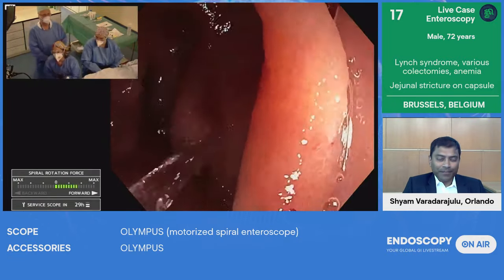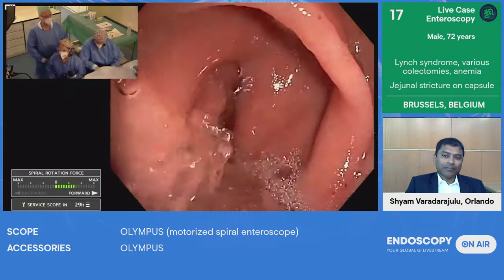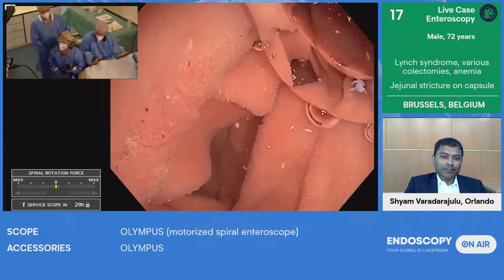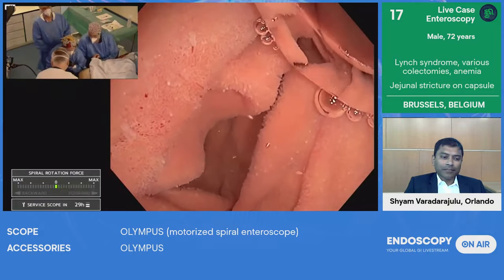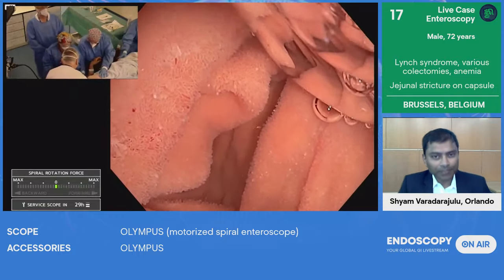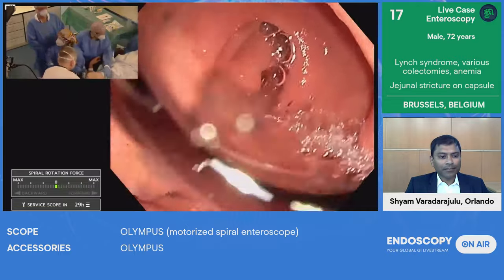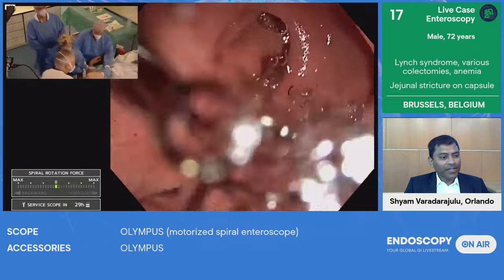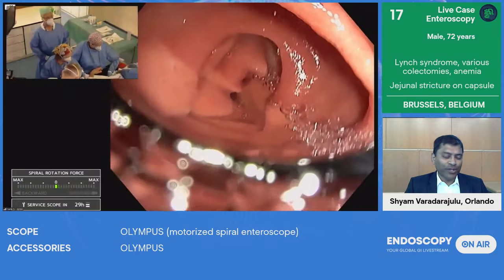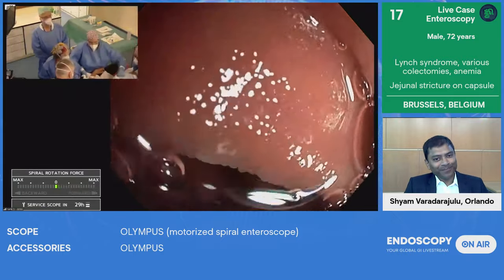Awesome. So sometimes changing the position of the patient may help. We have started with the patient in a left lateral position, which is the position that we prefer to start and the position which works most often. But here you see that I think that we might change the position. All right, Mariana and Jacques, we will watch you as long as we can. And then if we have to transition, we'll go to the next case. But it's a good demonstration. Thank you.